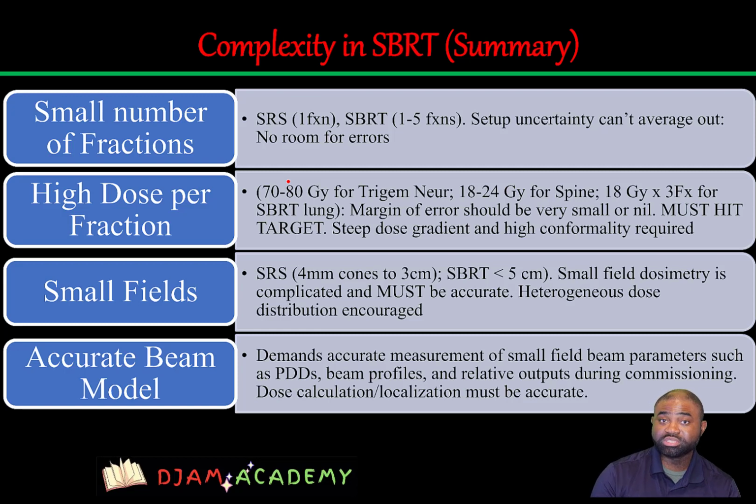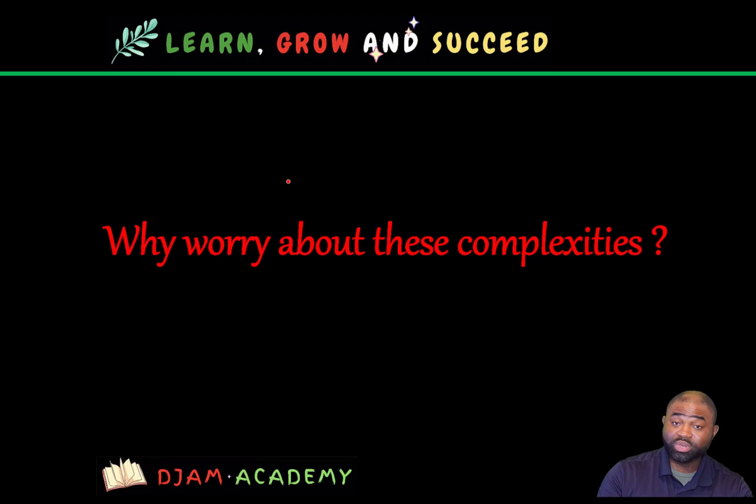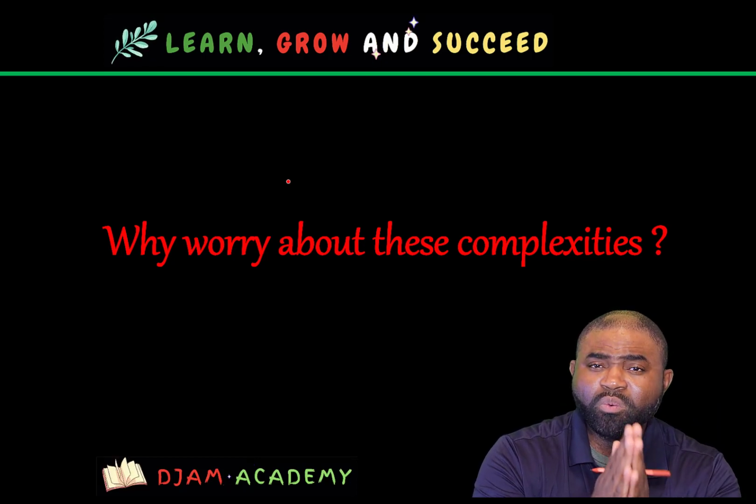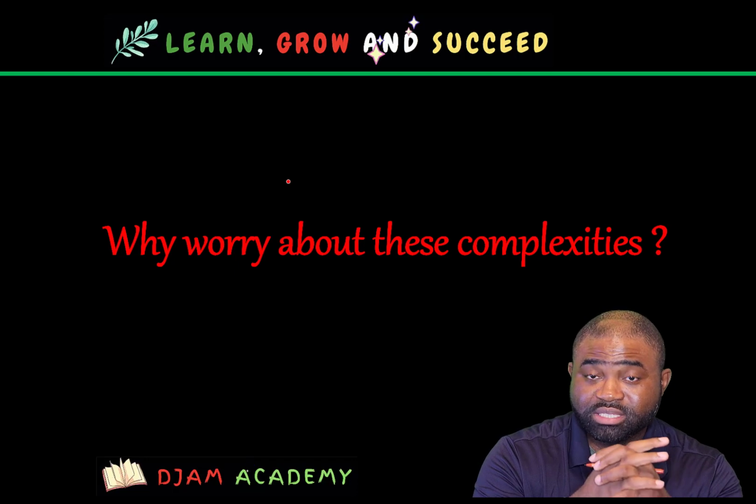And in order for us to get an accurate beam model so that our treatment planning system can calculate the dose distribution accurately, it requires the input of accurate beam parameters such as PDDs, beam profiles, output factors, and so on and so forth. And the measurement of these output factors for small fields is complicated, as you will clearly see. But the question, which I think is really legitimate for us to now ask and answer at this point, is why do we have to worry about these complexities?